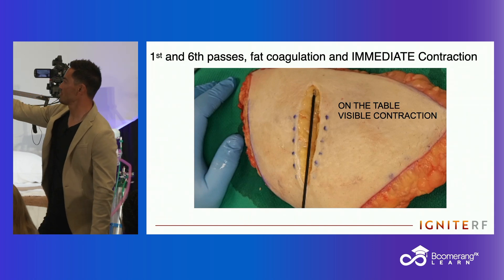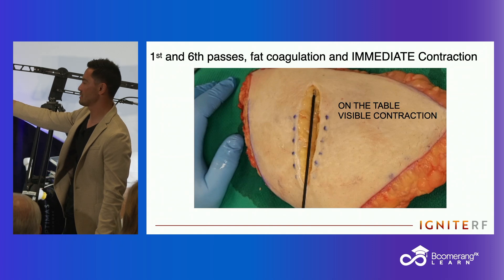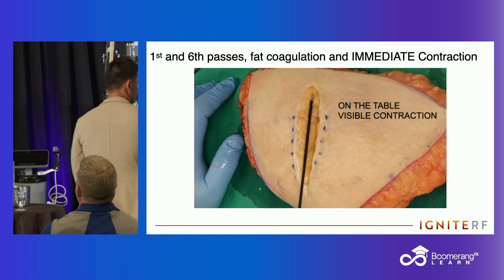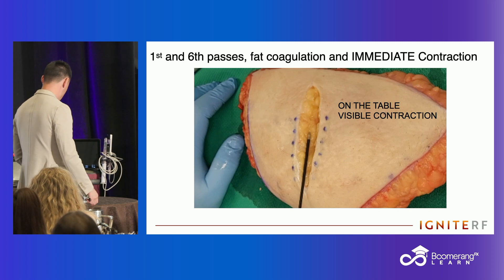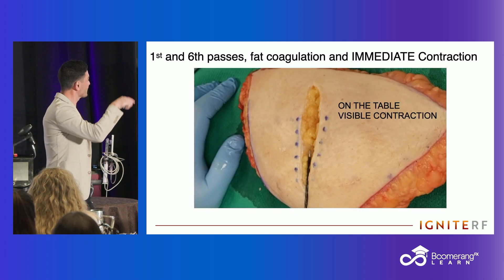I want you guys to see this — this is the first pass and after six passes. Just look at the width of this incision. Basically what this is showing is tissue contraction. Do you guys see this? Look at how much more narrow that is after six passes.